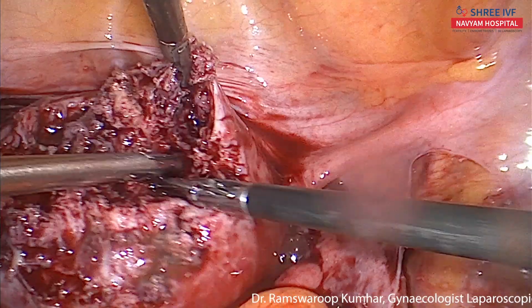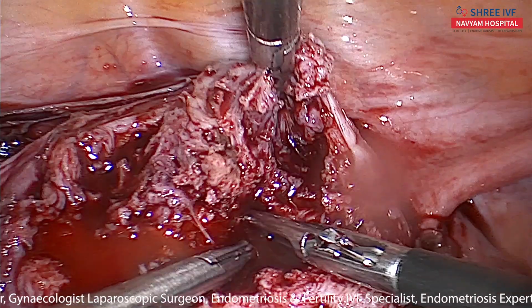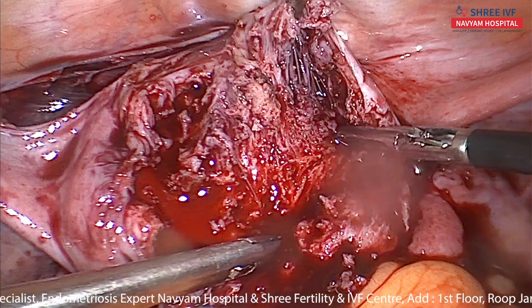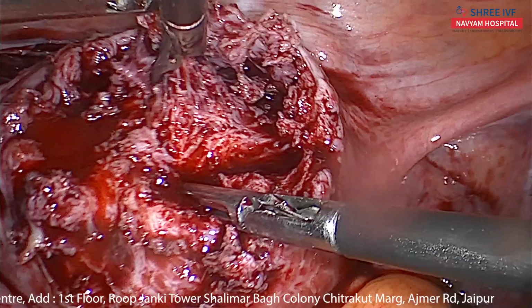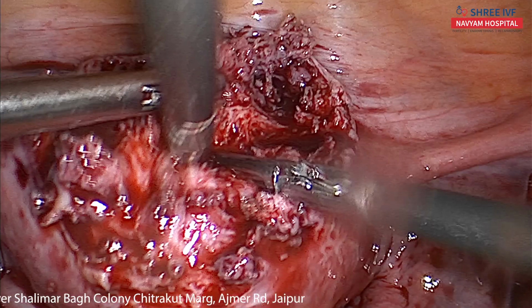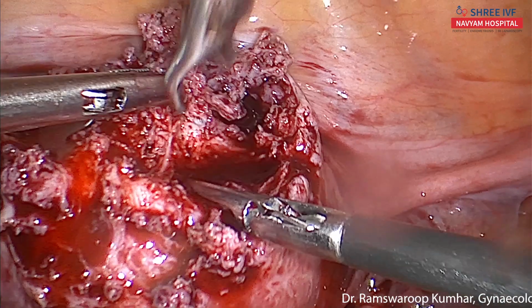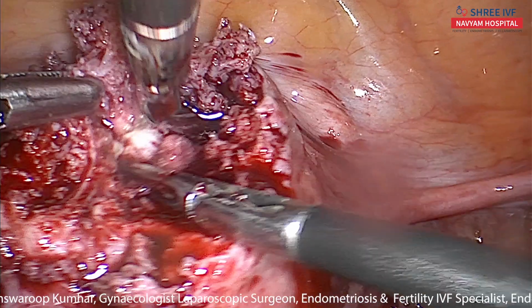Now palpate. No myoma. Try palpate. I think we should find another myoma here.